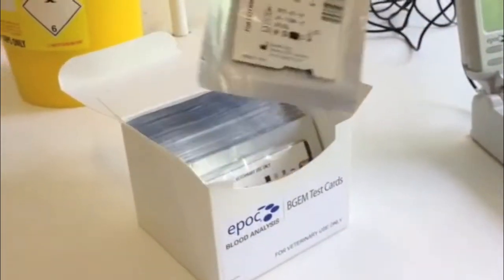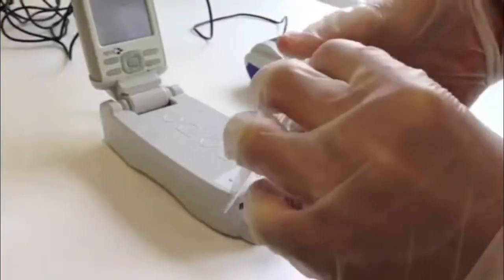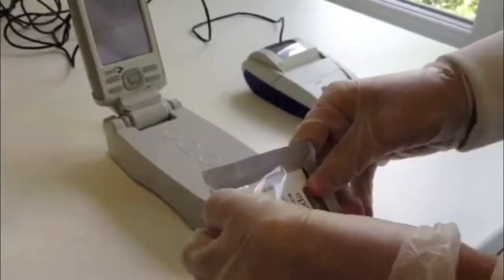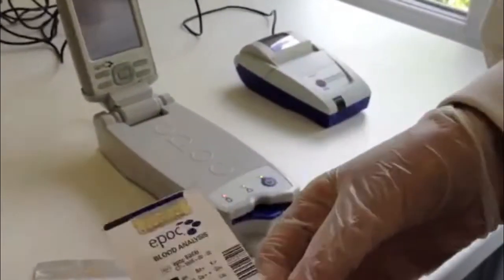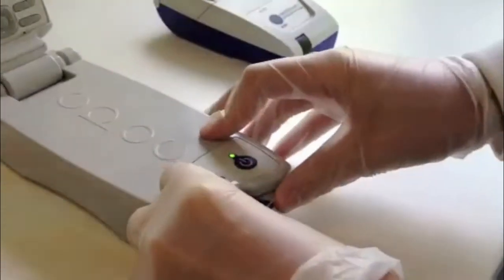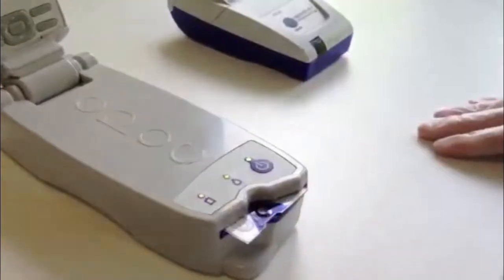Remove a card from its packaging and check the expiry date displayed on the test card. Turn the card over so that the blue area containing the sample well is on top. Using both thumbs, insert the card into the analyser in a smooth, swift motion, ensuring that the card is pushed through the point of resistance as it clicks into place. As the card is inserted, the reader reads the barcode printed on the card.